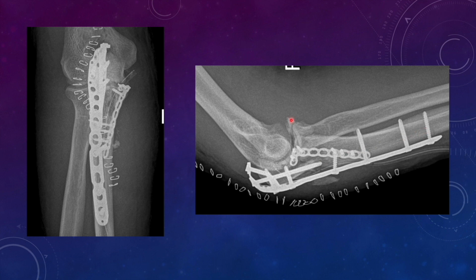Now as per the column concept, we have secured the coronoid, we have secured the sublime tubercle which is on the medial column. There was no separate fragment for the anterolateral facet, that is the middle column. It was a single chunk which was having the anteromedial facet as well as the anterolateral facet. Therefore we had to fix the coronoid as a single block.